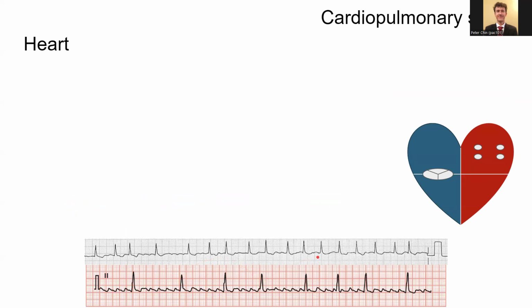One thing that really helped me learn EKGs was not only comparing normal to abnormal, but comparing abnormal to abnormal. Because initially, when I was looking at EKGs, I would be like, okay, it could be this or it could be this, both of which are abnormal. And being able to differentiate, like, why is this diagnosis more in line with this EKG as opposed to this other one? So that's what we're going to do here.